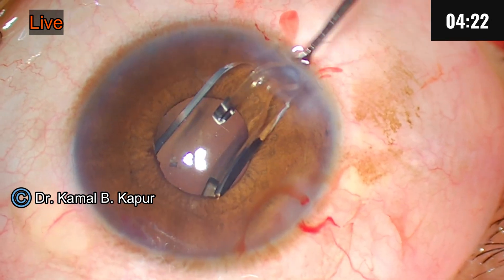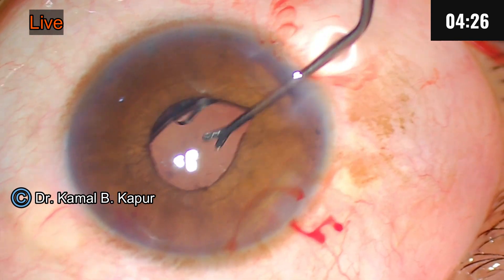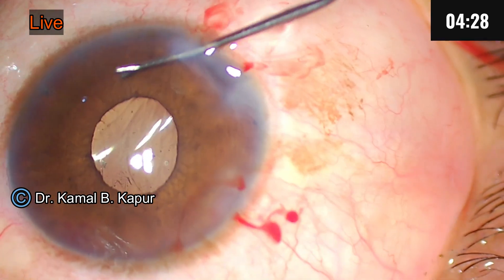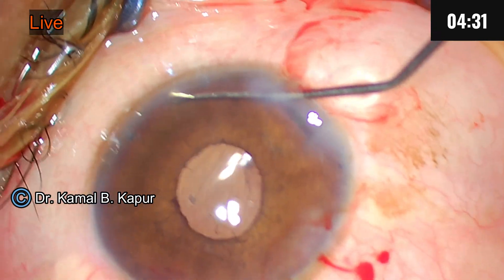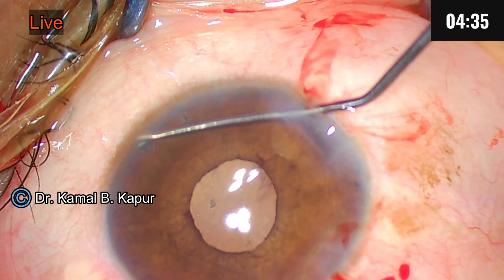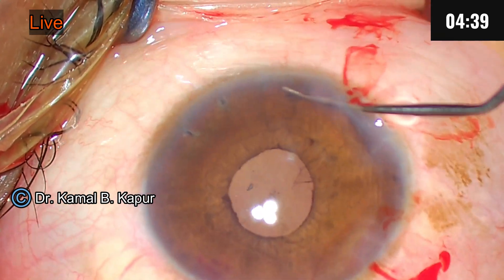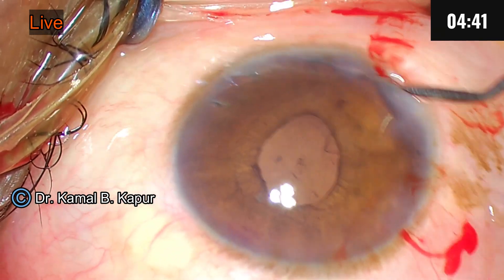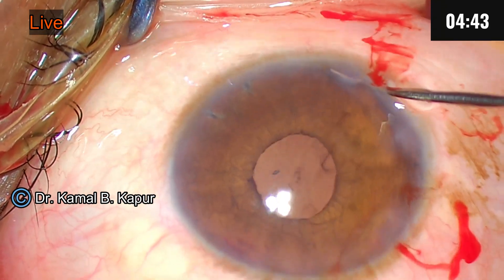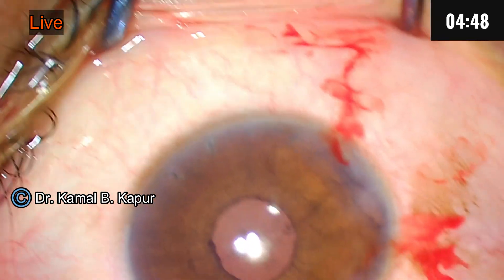We performed three peripheral iridotomies on the day the patient came to us. The first one is here, the second one you can visualize here, and there is another one here. These three peripheral iridotomies saved the day.